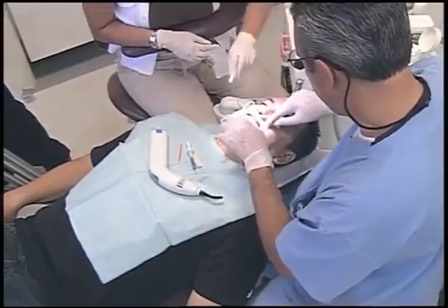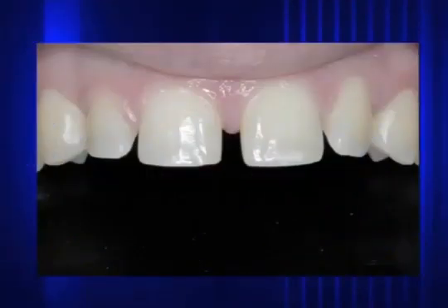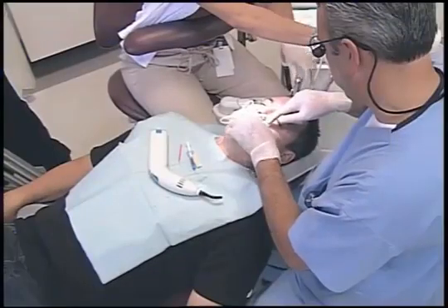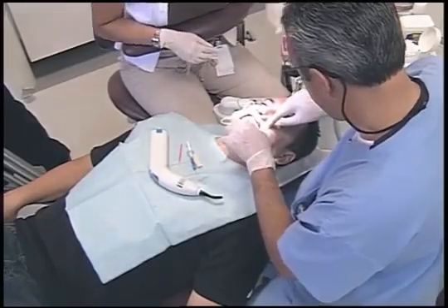Today I want to share with you a patient we treated recently. His name is Chris. He's going to be a no-prep veneer case using V-veneers. You can see the spaces that he's got between his teeth. He's a great additive type case, so this is going to be a good chance for us to really make an overnight improvement. Not even overnight. I mean, by the time we try in the veneers, he's going to get a chance to see what he looks like without any spaces in there.